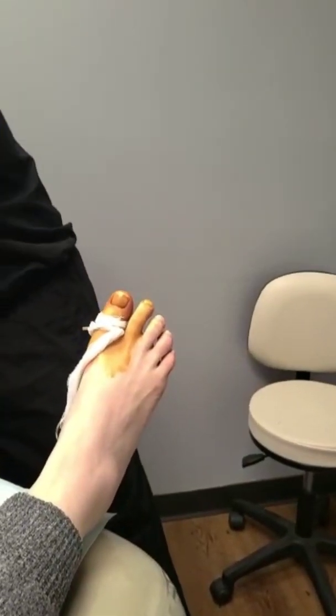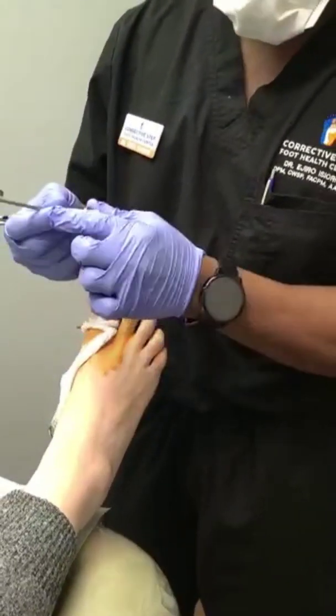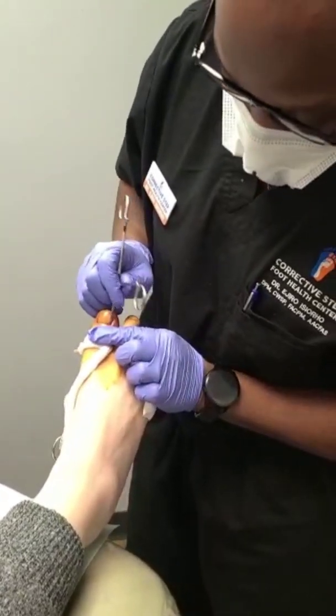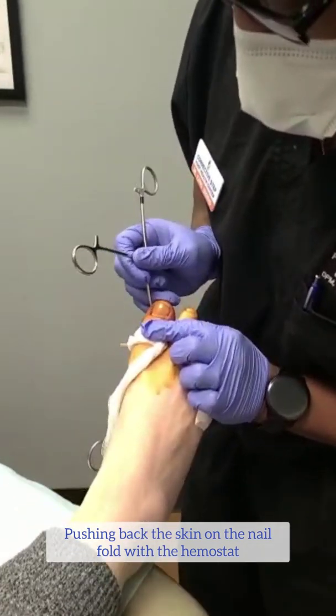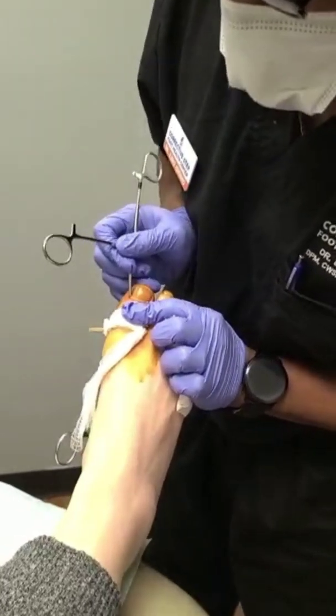Our patient is good and numb. We have our chemicals ready. We have our dressings ready. So I take my hemostat — there is a smooth side and a rough side. The smooth side always goes against the skin. And we loosen up the skin on the nail fold and push it back.